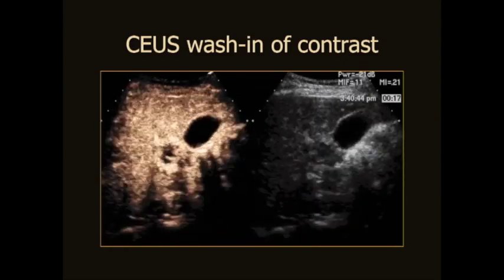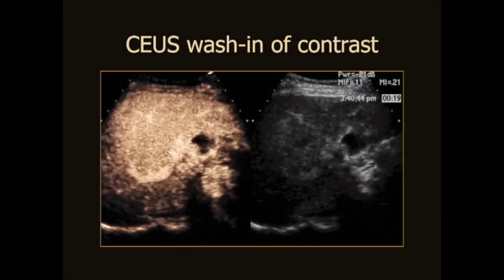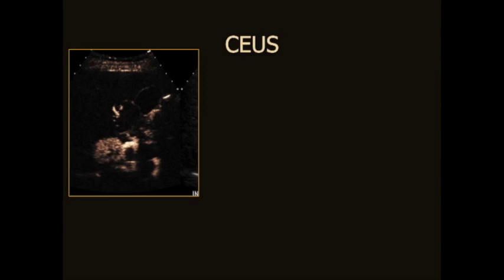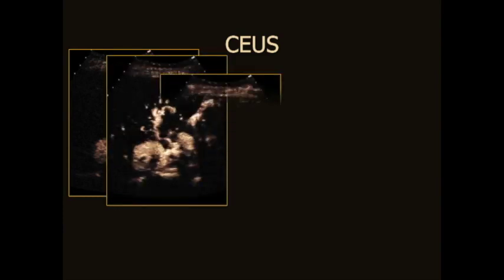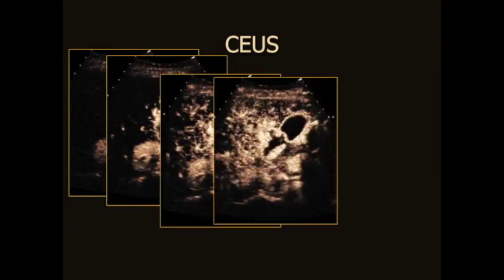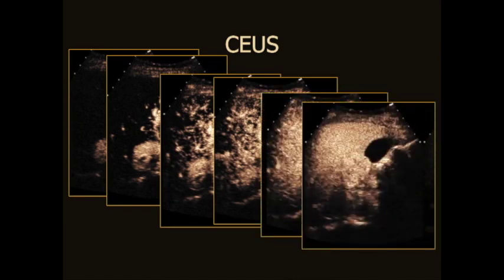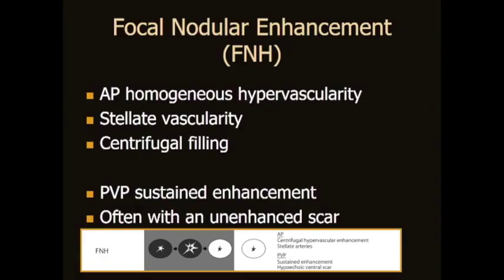This is the one lesion where we tend to move around a bit to enhance our capability to show the peripheral puddles. And so we can again extract these excellent images showing those peripheral puddles progressing centripetally and ultimately to complete enhancement, a classic hemangioma.